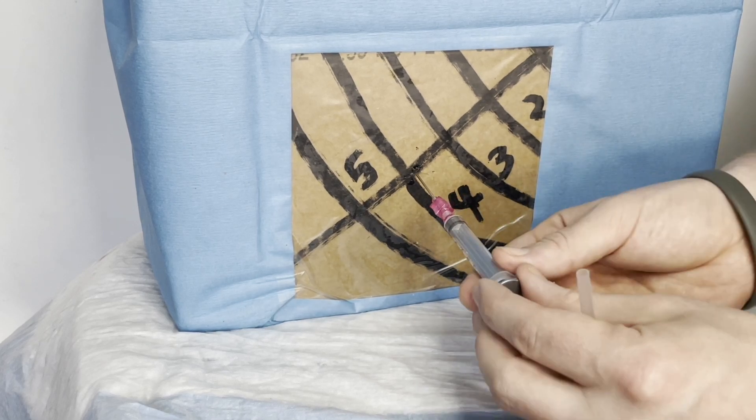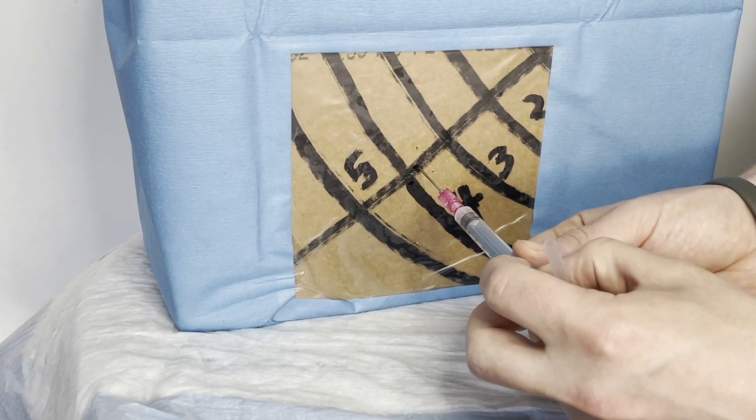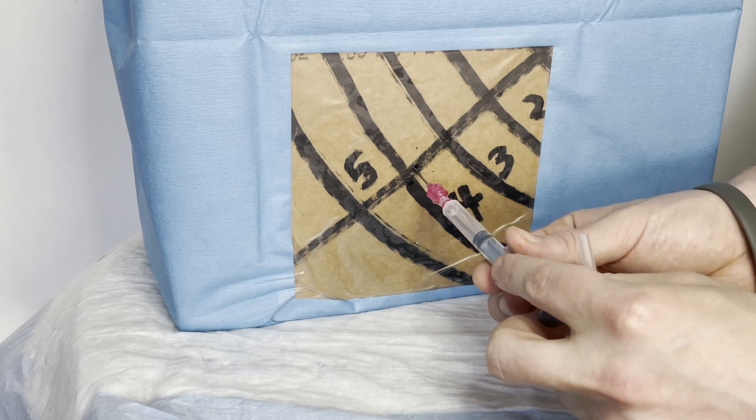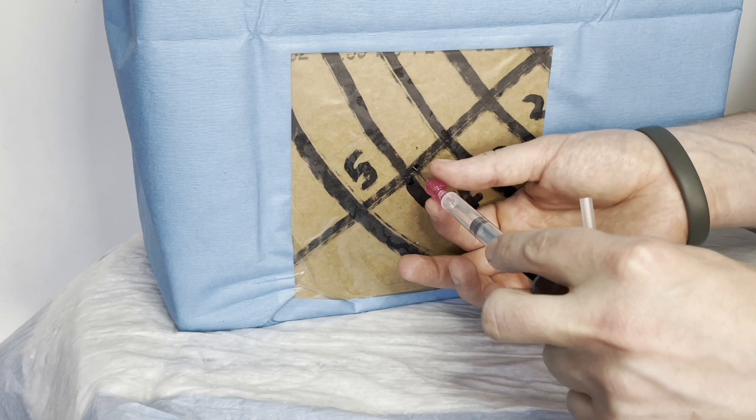And we're going to introduce our introducer needle at a 90 degree angle into the skin. And we're slowly going to aspirate. We've already numbed the area, and as soon as we get to the pleural space, we'll be able to aspirate air back.